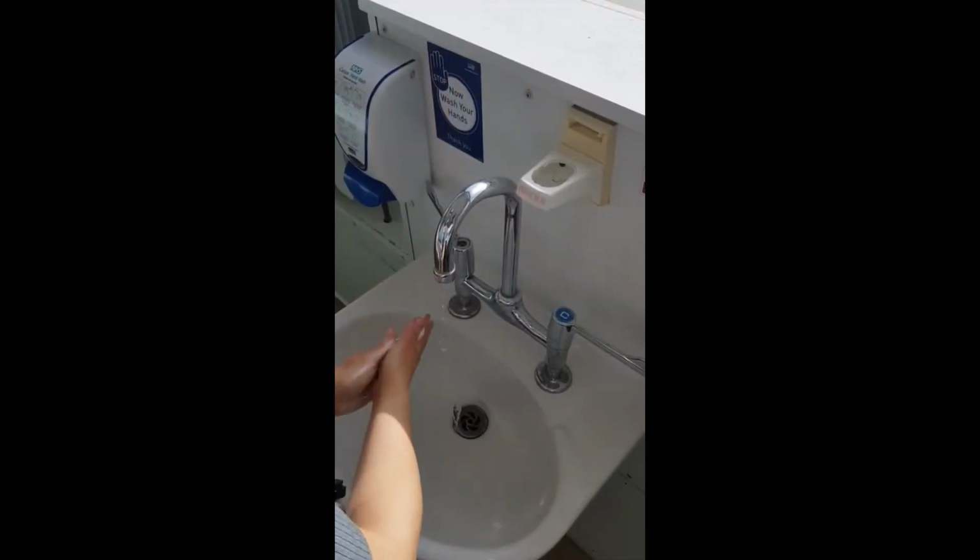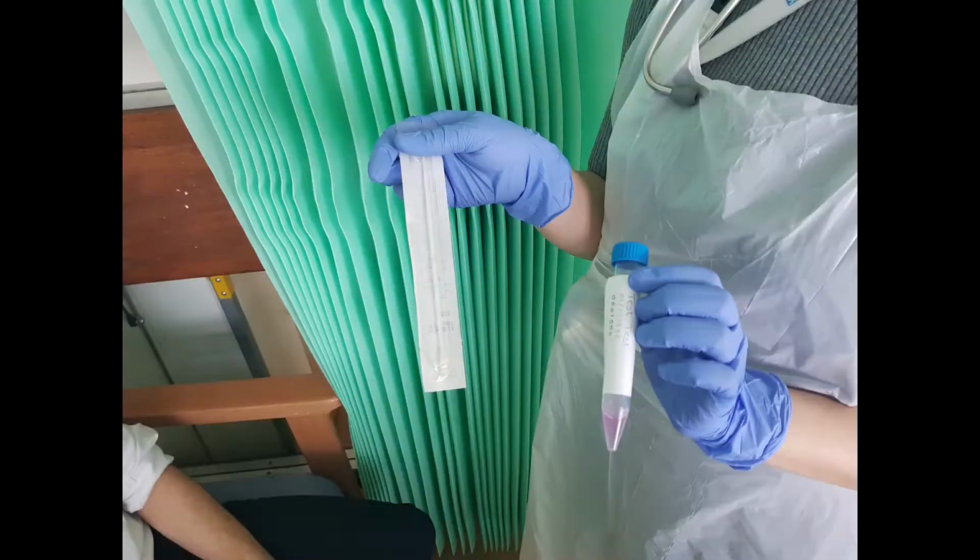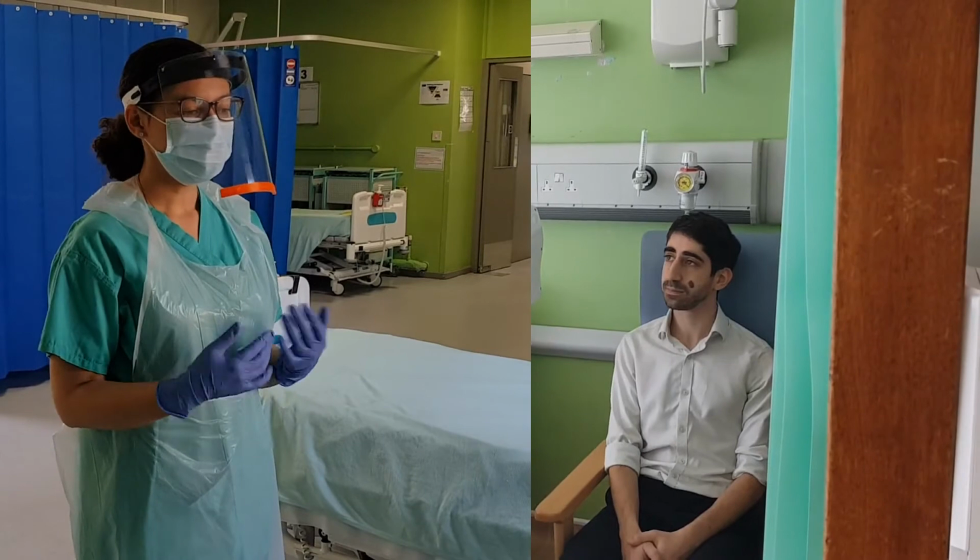Wash your hands thoroughly and put on PPE. Take the swab, the container, the specimen bag and the sample bag next to the patient. Explain the procedure to the patient and gain consent.